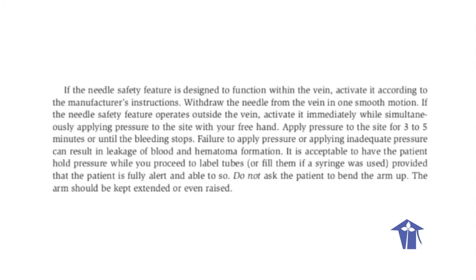If the needle safety feature is designed to function within the vein, activate it according to the manufacturer's instructions. Withdraw the needle from the vein in one smooth motion. If the needle safety feature operates outside the vein, activate it immediately while simultaneously applying pressure to the site with your free hand. Apply pressure to the site for 3 to 5 minutes or until the bleeding stops. Failure to apply pressure or applying inadequate pressure can result in leakage of blood and hematoma formation.